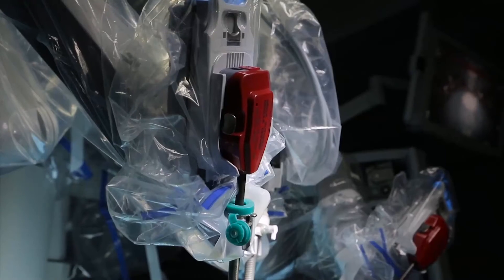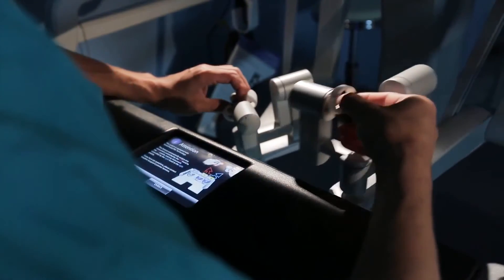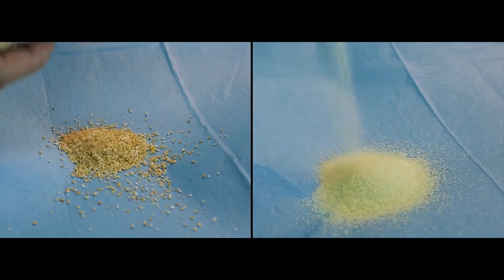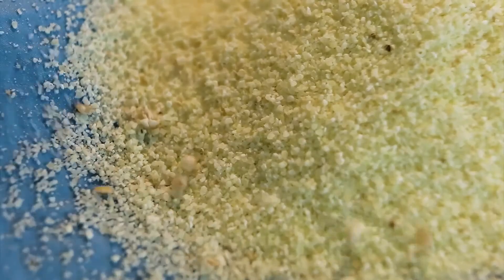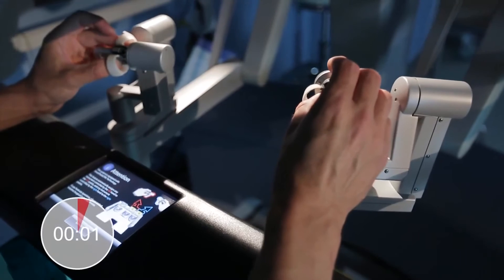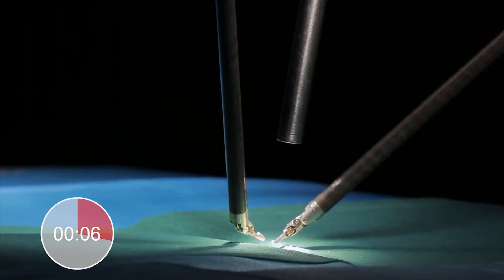Now we will prove that the robot manipulators really can surpass human hands and fingers. A simple yet unusual task. We mixed semolina and barley grits. How long will it take the Da Vinci to separate them from each other? If you think it is easy, then try to do it yourself.